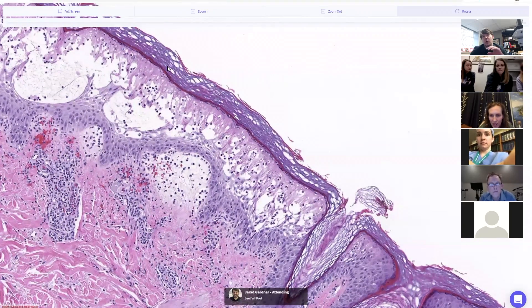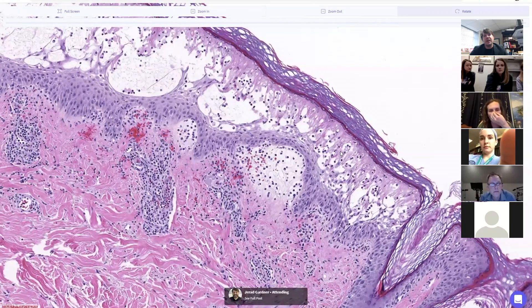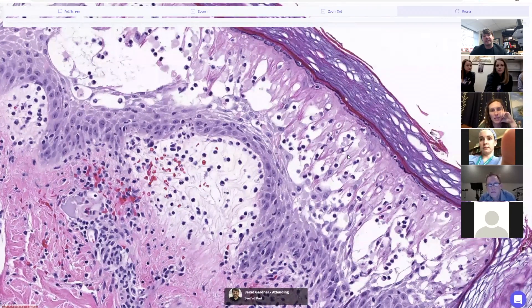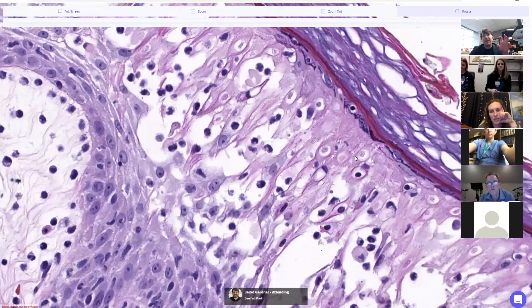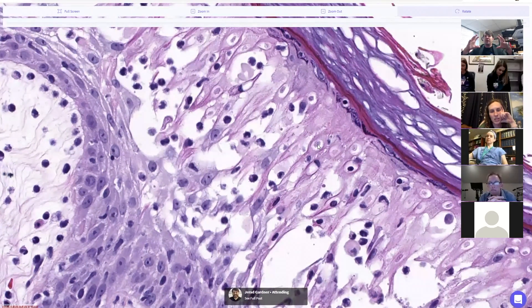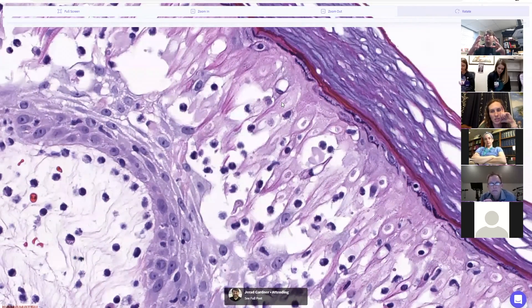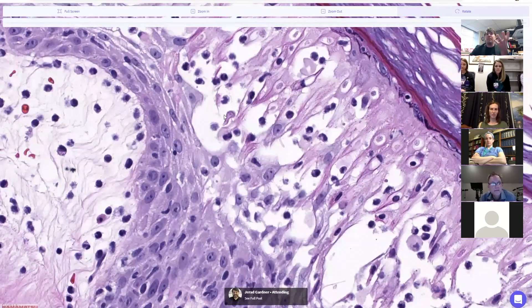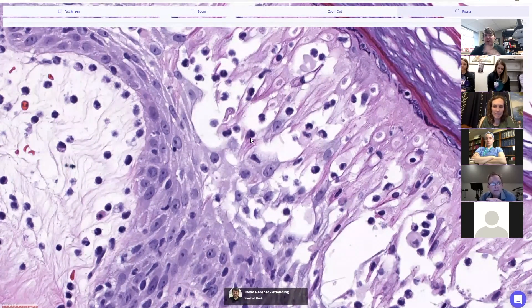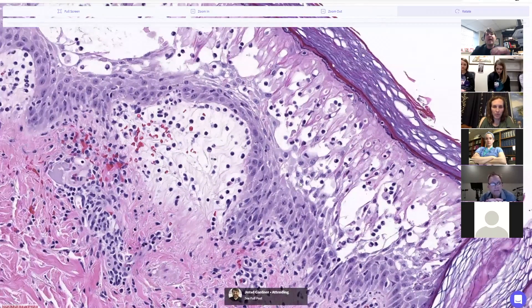The corneal layer is totally intact and normal, and we have what we call ballooning degeneration. The keratinocytes are pale, dying, swollen, and enlarged — they look pumped full of fluid, more pale and enlarged than usual. There's also a bunch of spongiosis in between them and they're kind of falling apart.